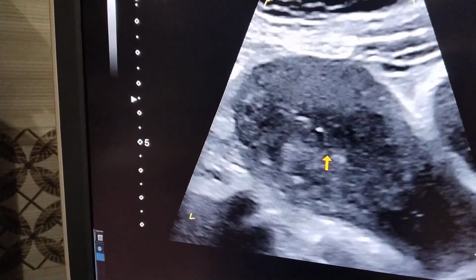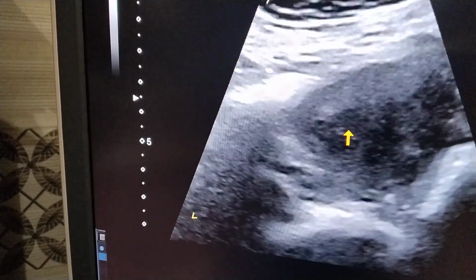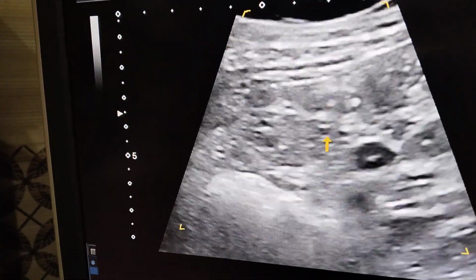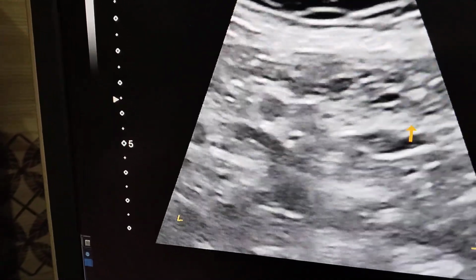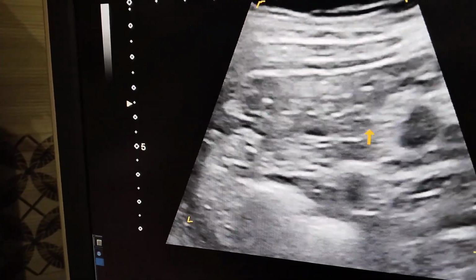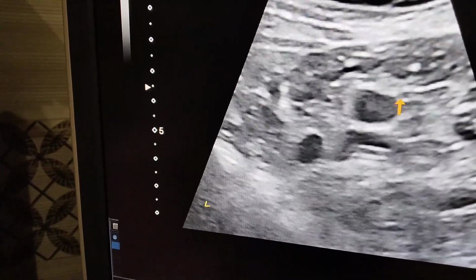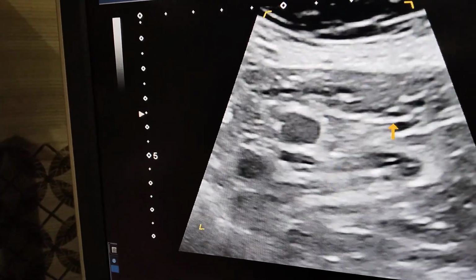So here we can appreciate this is the adenomyosis of the uterus, and then there is the extra pelvic involvement of the endometriosis involving diffusely the omentum, greater omentum of the abdomen, which has appearance of heterogeneity, increased thickness, hypoechoic.